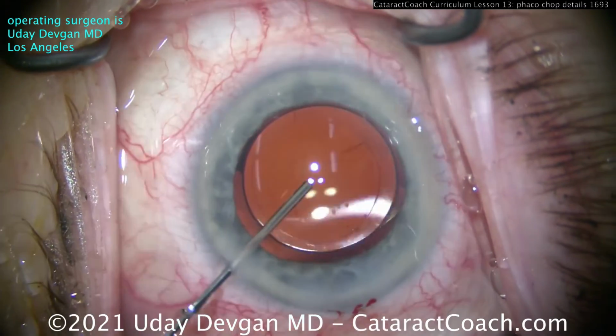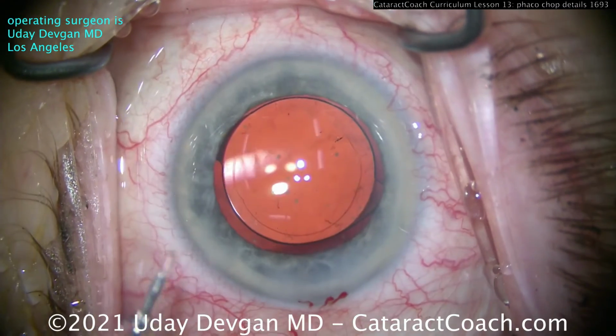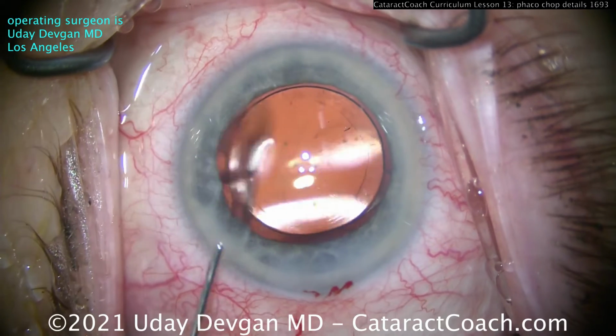So try this technique. I call it combo chop. We have many videos here in Cataract Coach, and I think you'll learn to do this technique quite well.